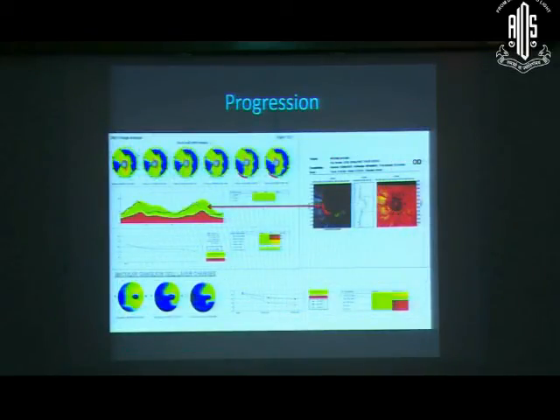Progression, we are part of something known as the UK glaucoma treatment study, which is the first study which has shown that treatment for glaucoma actually helps. This was a randomized double-blind controlled study. Part of the study was imaging. We did a lot of imaging, HRT and OCT, and both have actually now shown that you can pick up progression purely by structural means. The Canadian glaucoma study has for the first time correlated slowing down of HRT disc loss to intraocular pressure reduction as such. And you can see here that again macular volume is being lost as such.